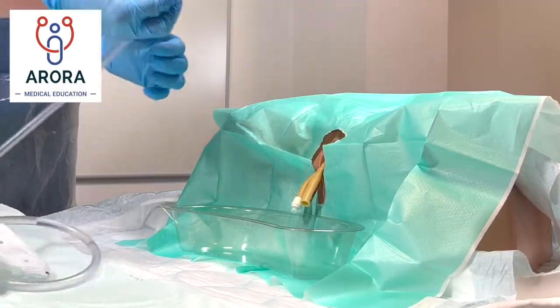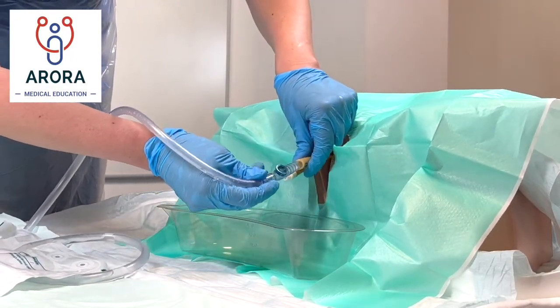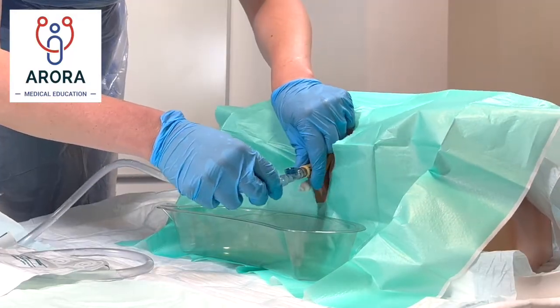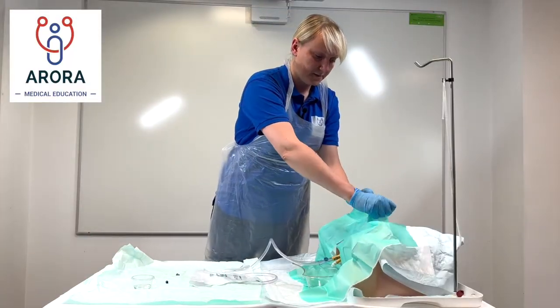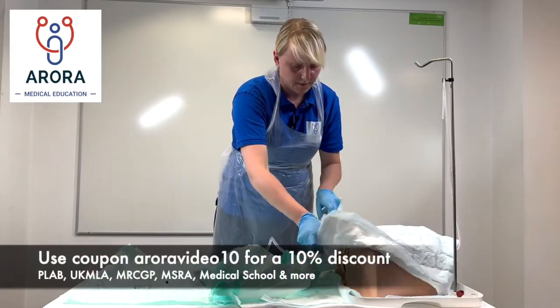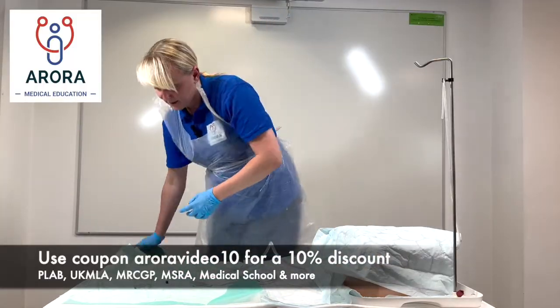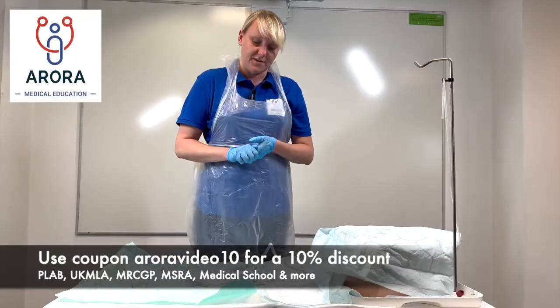'I'm just going to connect the bag to your catheter which will collect your urine as it drains through. Thank you very much Mrs X, we're all done. I'm just going to clean the area away and get you covered back up — let me know if you feel any pain in that area. And finally to complete things I'm going to document everything in the notes.'